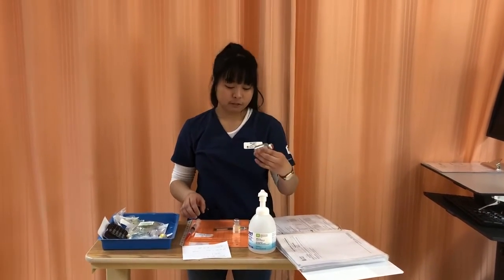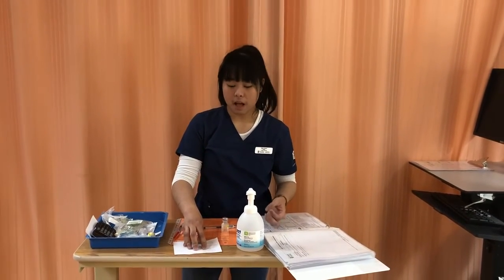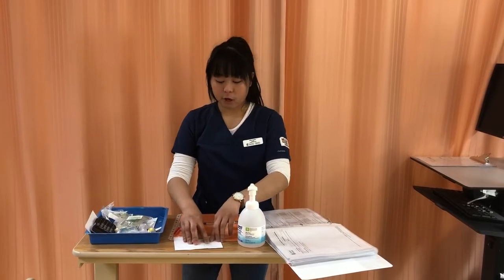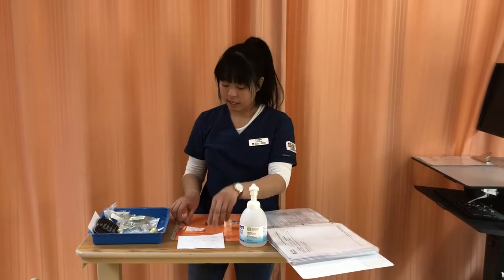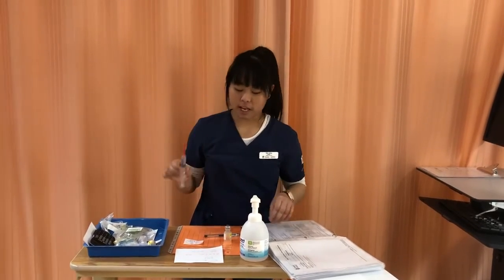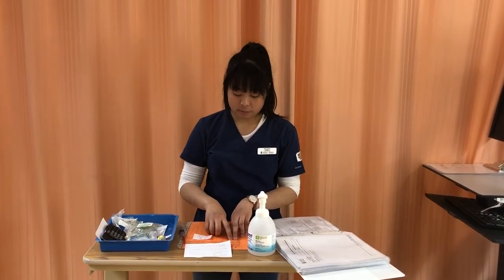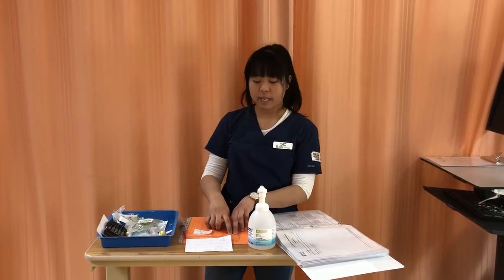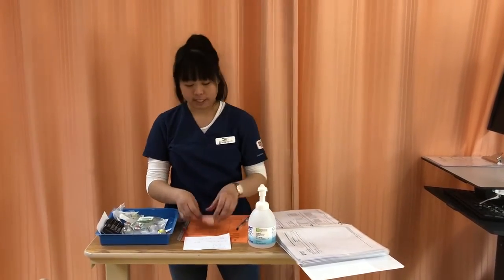I have a 5 million vial, so my final concentration will be 500,000 units per ml. Therefore, my total medication volume will be 6 mLs, and I have 6 mLs in here, so that's the right dose. And I have IV, it says can be given IV, so that's the right route. And it's to be given every 4 hours, and it's due right now, so that's the right time and frequency. So now, I'm ready to go to the patient's bedside.